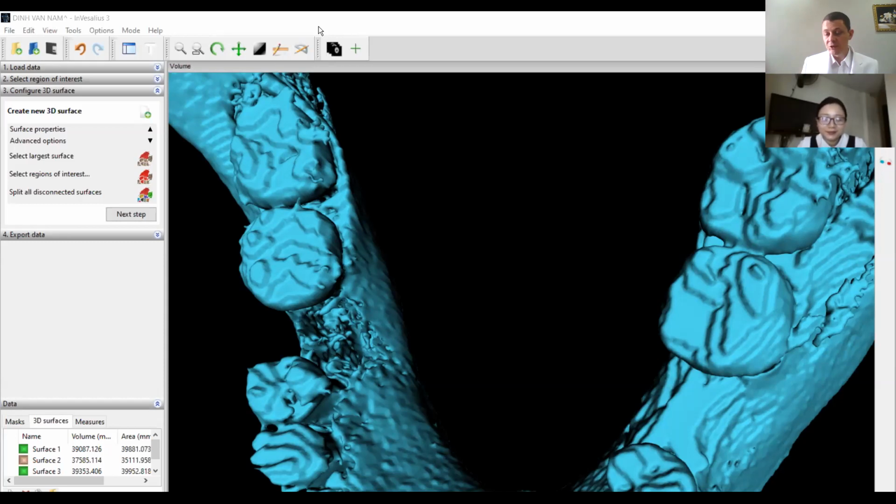The case that he showed on YouTube and presented at the AAO, at first he published the final panoramic, and yes, the 7 was tipped 45 degrees. When he presented at the AAO, he did not show the final panoramic, he removed it, but it was still visible on the initial YouTube. And when he shows the lateral cephalometric, he cuts it so that you see only the anterior sector. I cannot tell you, you don't have the space to move back the 7.